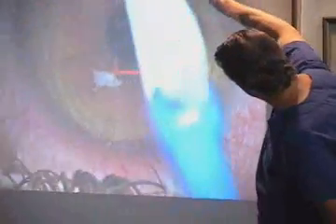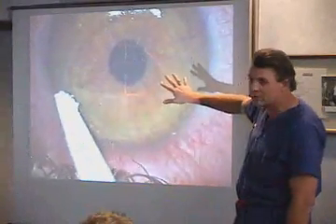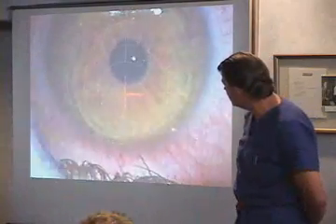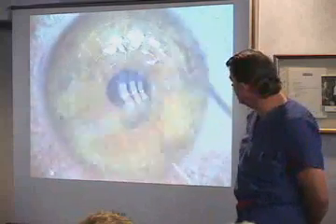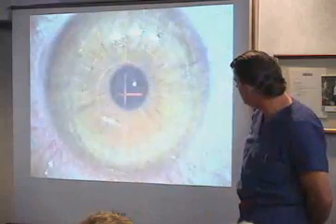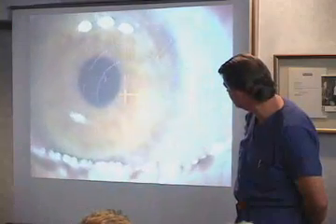And now what I'm going to do is I'm going to just check the margin with one of these little sponges. And you'll be able to see that as I come down here, this little rim right here, this is the part that will fill in with cells by tomorrow morning. But till that does, I do not want him to touch either one of those eyes, okay? Once that fills in, the structural integrity of the flap is so much stronger. Put a little fluid on top because it's dry. I don't want him to blink when it's dry. And then we'll take the lid retainer out. You've all got that many veins on your eyes, believe it or not. And he's going to blink a few times for us and show us that everything stays put.